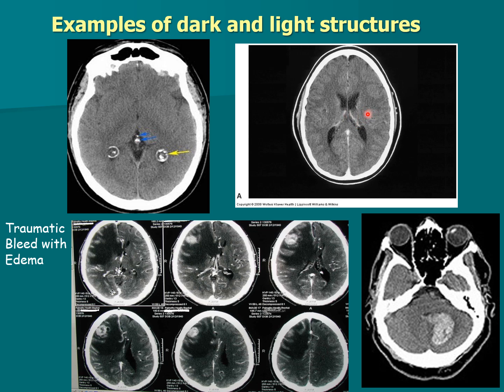It could be a bruise, but a mass effect means that things are shifted on the midline. But here, that falx cerebri is completely midline. So this is a traumatic bleed with edema. So at different levels, this is just edema, the black part. The brain has liquefied, and it basically is fluid in the brain now where the tissue has died. It probably came from this bleed that the person had.